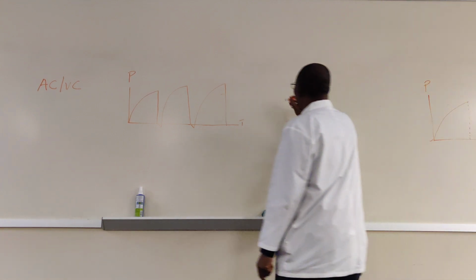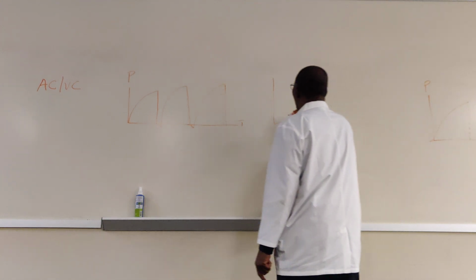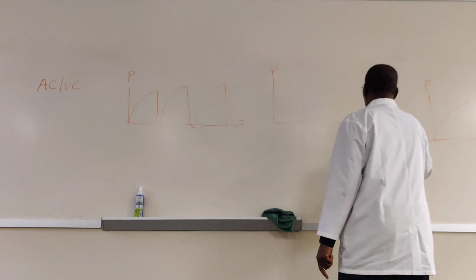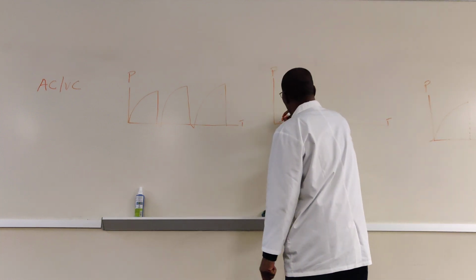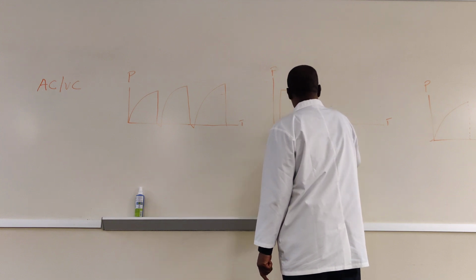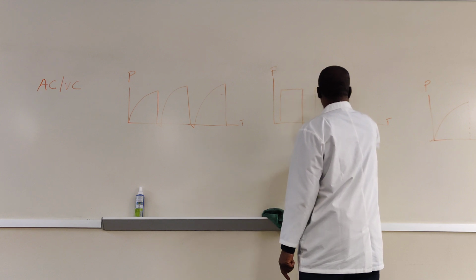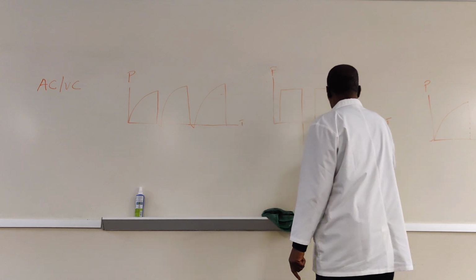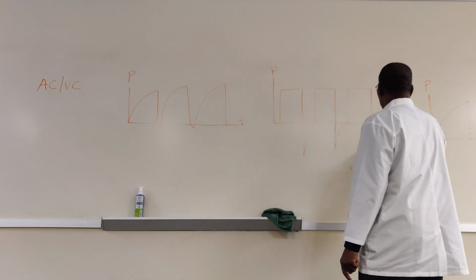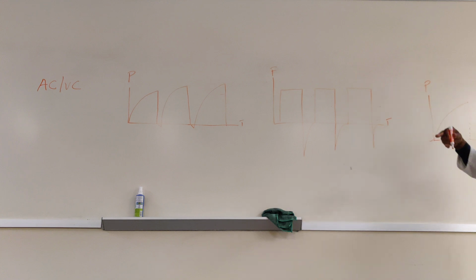Okay, so the flow time curve there, I'm setting my flow. It will look like that. They will always be the same height because it's the same flow rate. Okay, they'll be the same height.